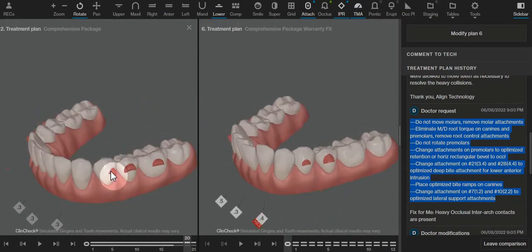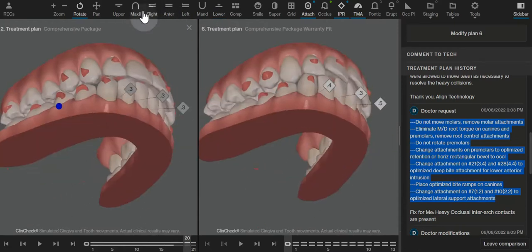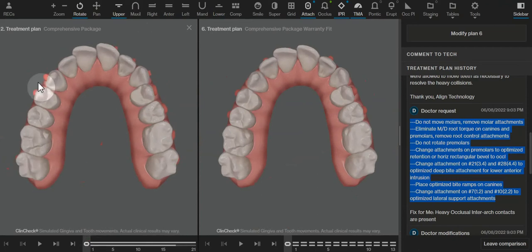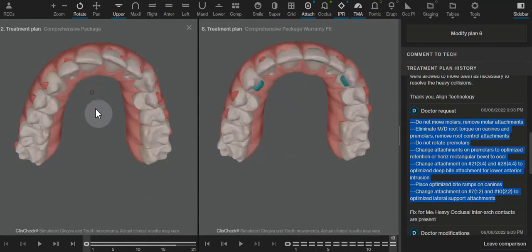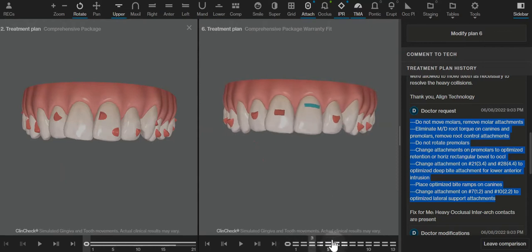I do the same thing for the other side, and then look through the upper arch. I see that this premolar is rotating. Looking from the beginning, although it's in a little bit of a rotated position, it's really not a very big noticeable movement, so I'd rather just do expansion instead. I also find these attachments to not be very effective, so I generally will change these to the optimized lateral support attachments. An attachment that's more centered on the tooth, for the most part, is going to be more effective.